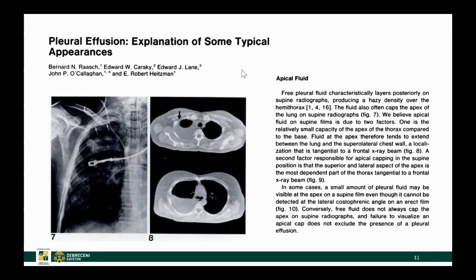In the supine patient, when there isn't too much fluid within the pleural cavity, it might be a little bit difficult to pick up pleural effusions, because you won't see the diffuse, almost homogeneous opacity. Imagine your patient has some pleural effusion, but not much — as you can see on this CT taken just below the carina. On the topogram of the CT, which is very similar to a chest X-ray, you can see that the lung is not opacified by this much fluid, and the fluid is barely visible at all.